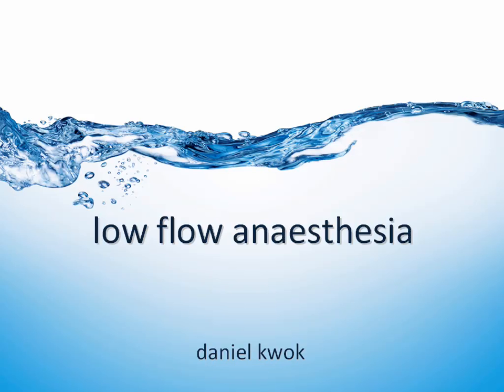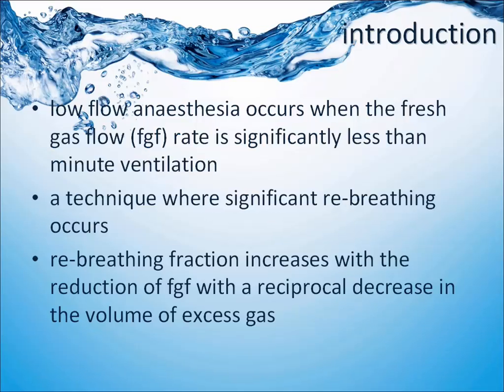Okay, so today I was just hoping to provide an overview of low flow anesthesia. When I started my training, it wasn't until probably about second year that I was introduced to the topic. I did notice that it was not being used widely, probably because the choice of inhalational anesthetic agents limited our use of low flow anesthesia.